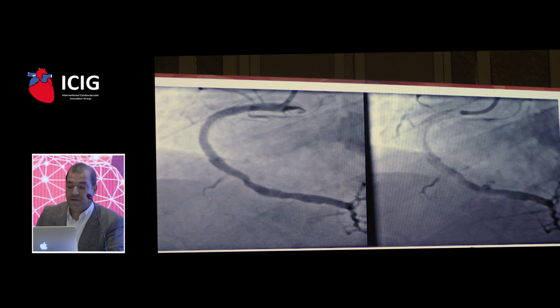Apparently, I had a complete strut fracture of the stent that I placed inside the old stent. I measured it; it was 4.0 by 18. The total fracture of the stent was 10 millimeters, so 8 millimeters of the placed stent was in place, and the remaining part, completely fractured, unfortunately slipped distally.